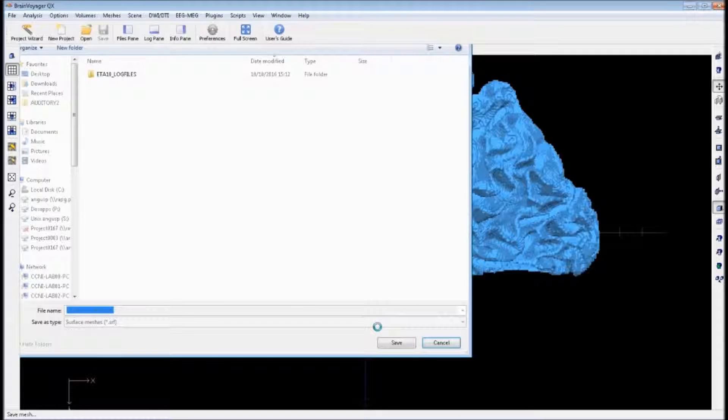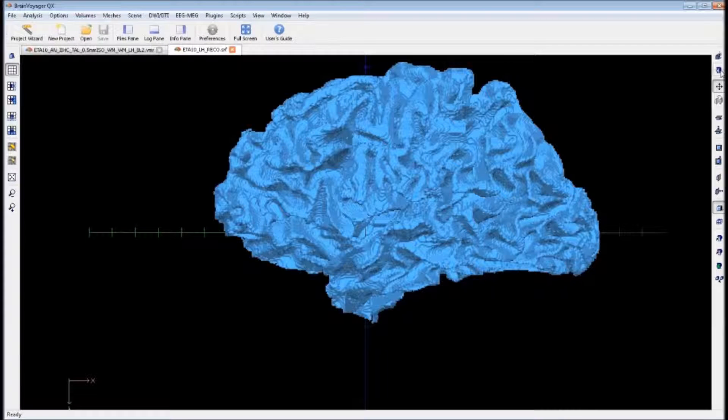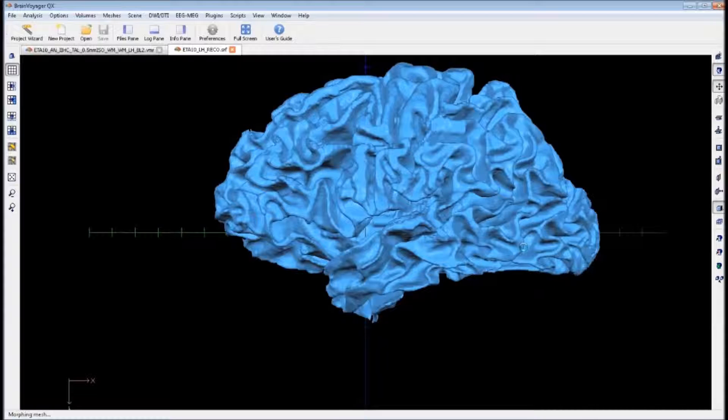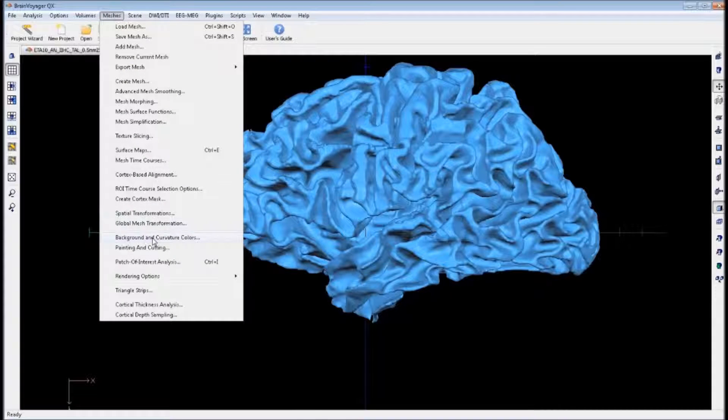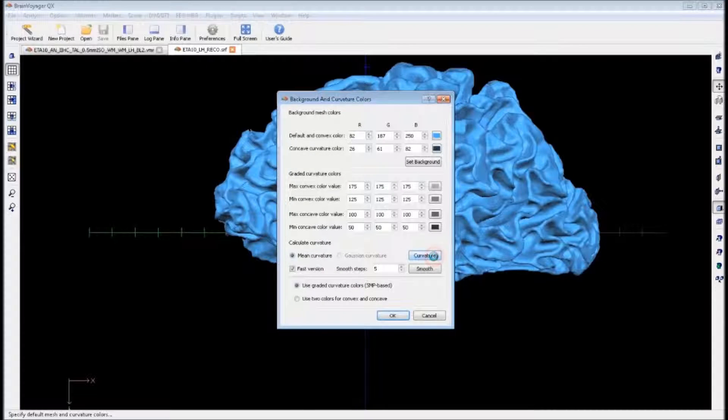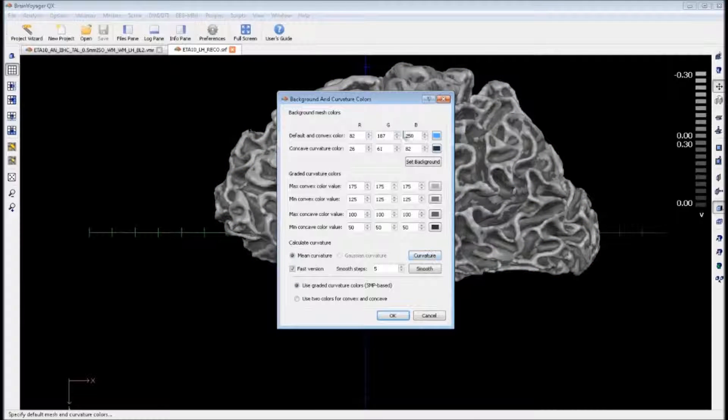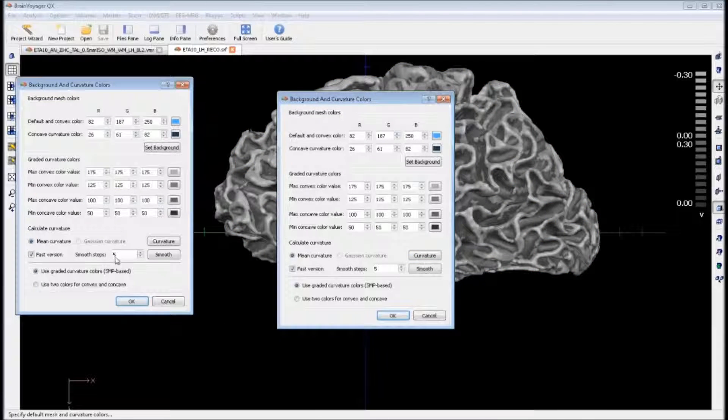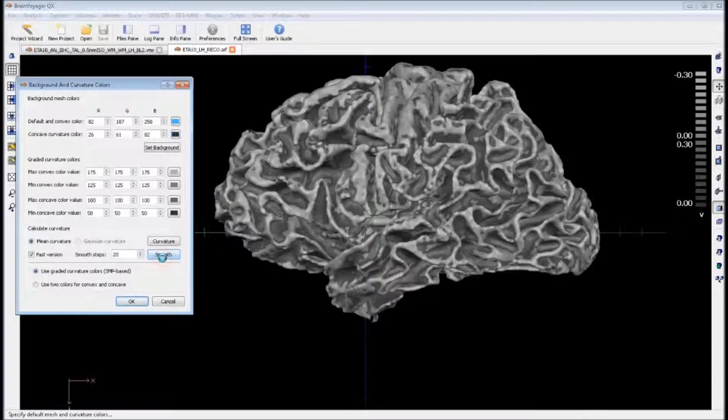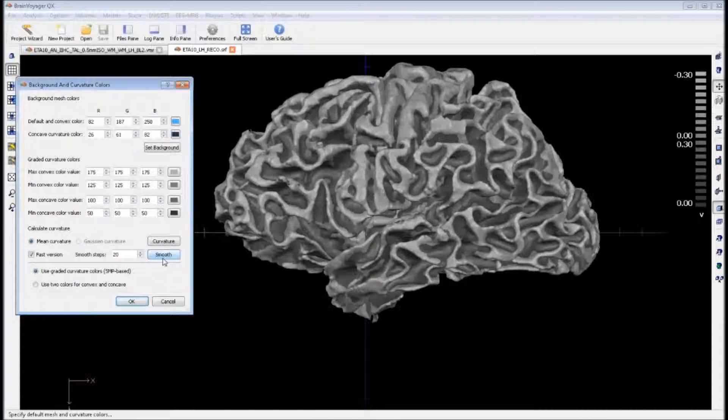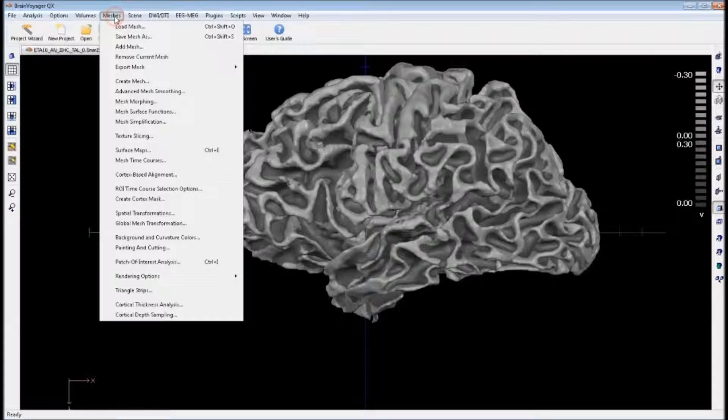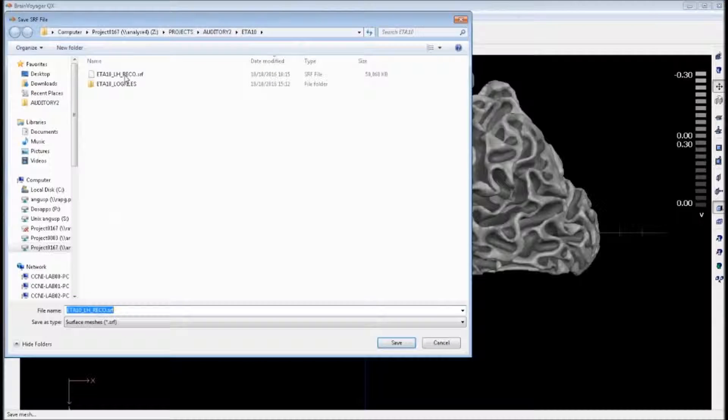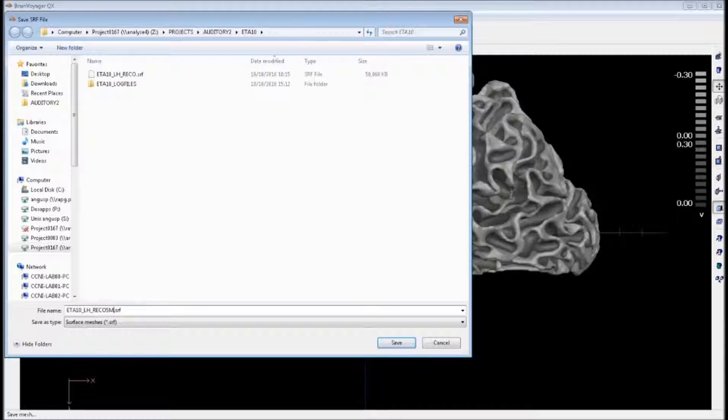Next, we want to smooth the mesh. If we click the button directly under the previous one, it will smooth the mesh out for us. Then we can go into meshes and apply some background and coverage colors. The number of smooth steps for this high resolution mesh is about 20. We get this lovely looking mesh. We want to save this. We can just add SM to the end of our previous file name for smooth.